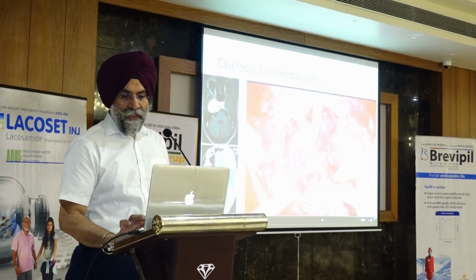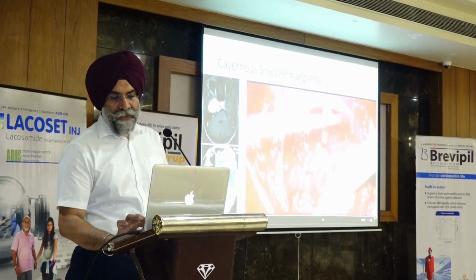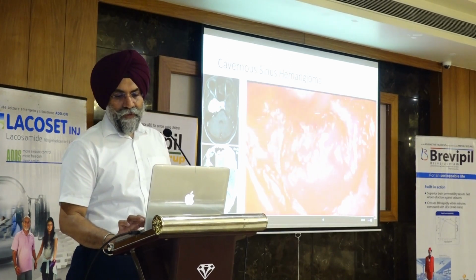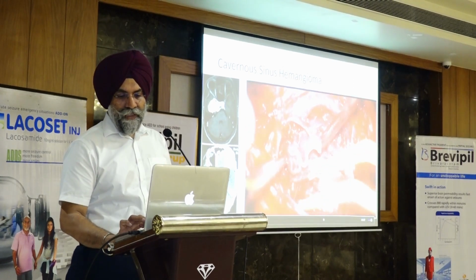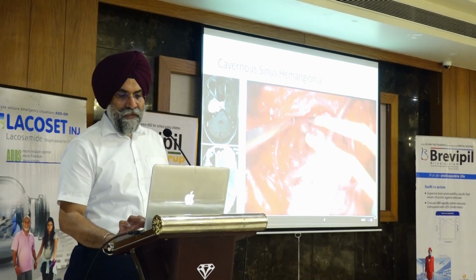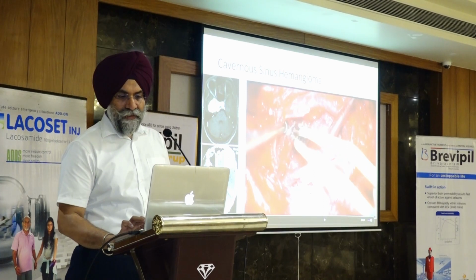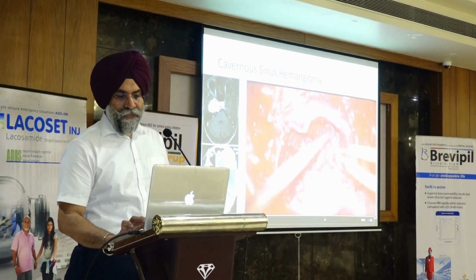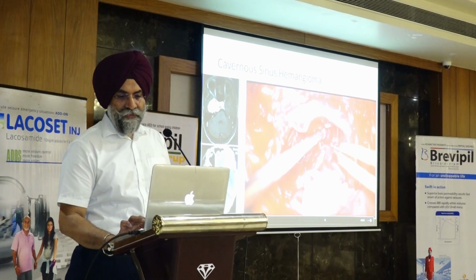Now there is the intrasellar component. So the ICA is actually inferiorly somewhat here. Okay, the cavernous sinus component is gone. Now it is the intrasellar component. Because the ICA is anteriorly pushed, I have actually seen it. It is somewhat here. So again, we are just looking around for the plane of cleavage from there.